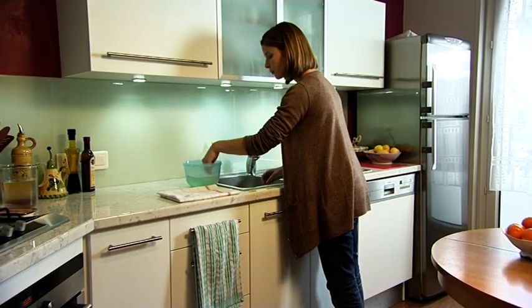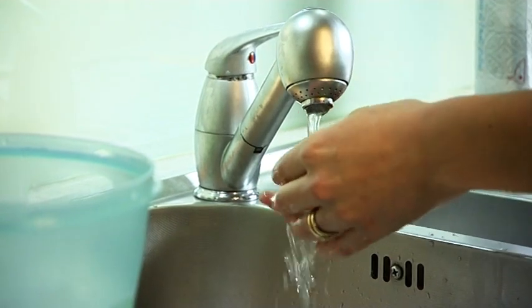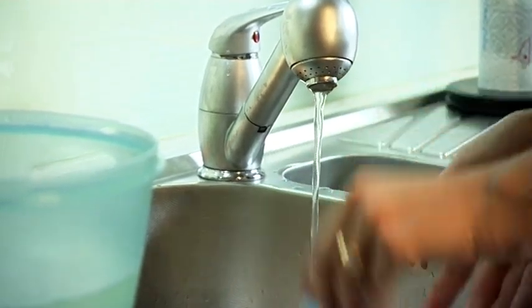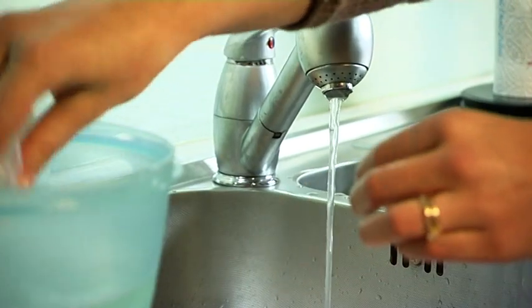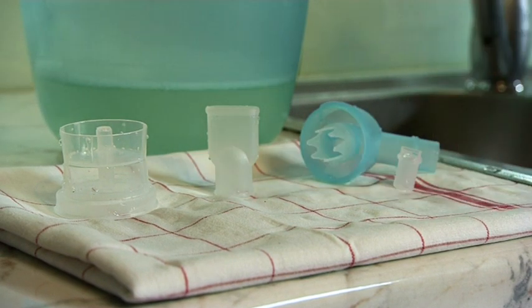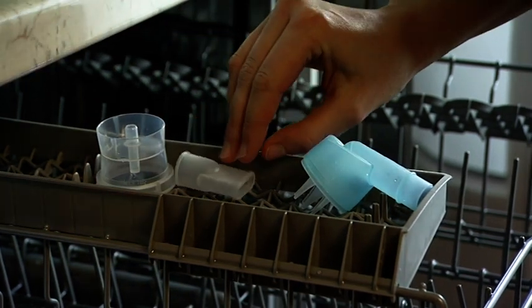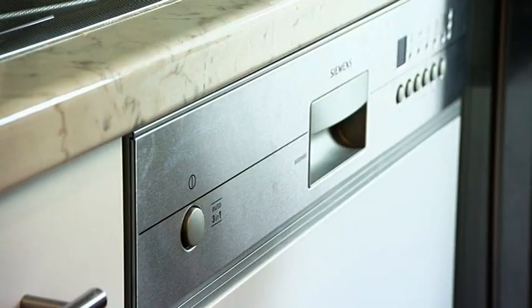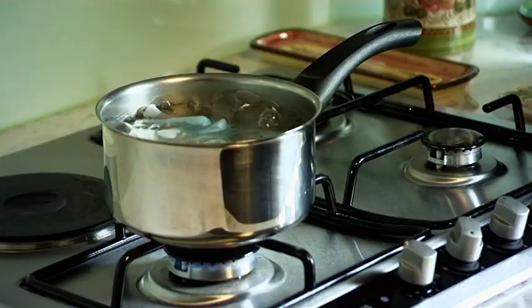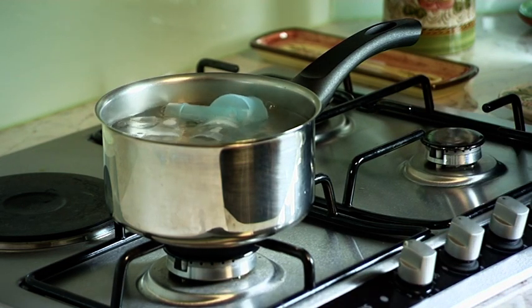In that case, rinse with water and let dry. Thoroughly rinse all parts with water again. Let them dry on a clean towel or kitchen roll. You can also put all the parts in your dishwasher. To disinfect the parts, you can put them in boiling water for 20 minutes. Make sure all the parts remain below the water.